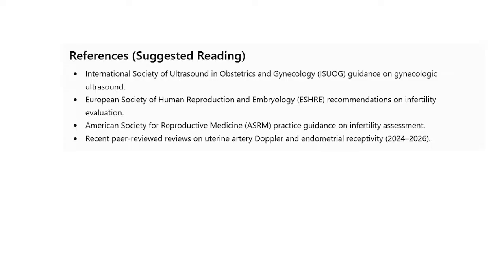Do not wait for the clinicians to bring things they need. Show them your skills, what you can do, and also tell them what can be done. Go and have a discussion with your gynecologist. Guys, do you know that if you are using ultrasound, the spectral Dopplers, power Doppler, color Doppler, they can assist us in assessing the vasculature of the uterus itself using the uterine arteries? And then you can explain the merits in terms of fertility assessment. Then you can start to implement it yourself and then recommend it to the doctors.